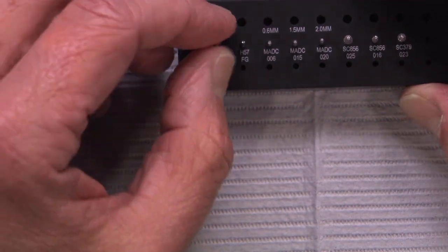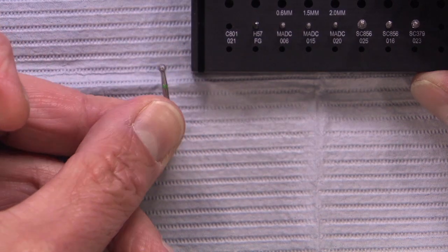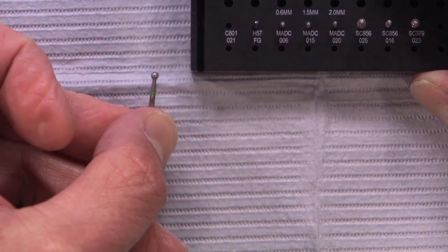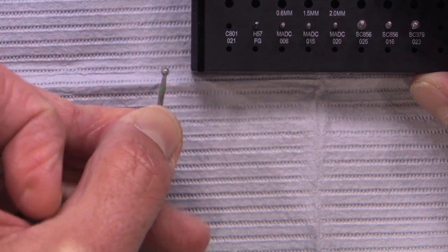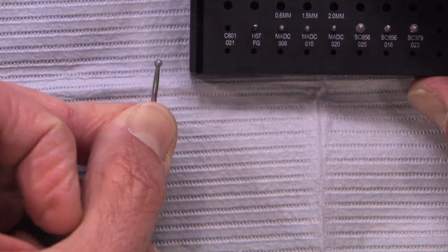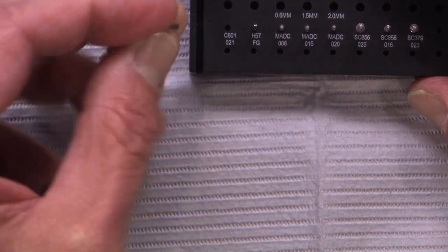One of the quick early burrs you're going to see us use is this 801-021 burr. This is a burr that you may have used for operative or some sort of round diamond, not typically a crown and bridge burr, but you're going to see how we use this very early in the technique to prepare the gingival margin.